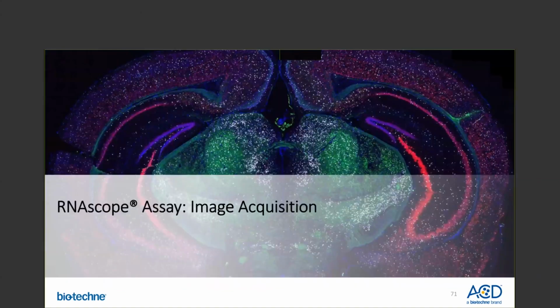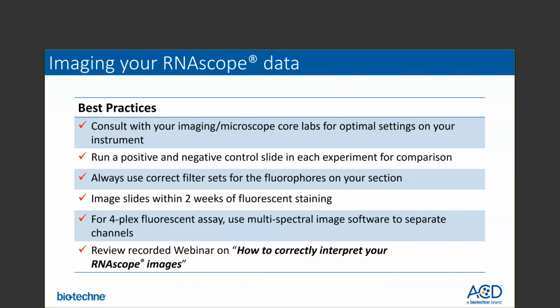I will now discuss how best to capture high-quality images for subsequent data analysis. Here are a few general guidelines to follow when acquiring images from your RNAscope assay. Consult with your imaging or microscope core labs to determine the optimal settings for your instrument.